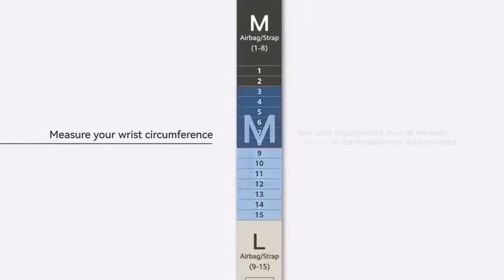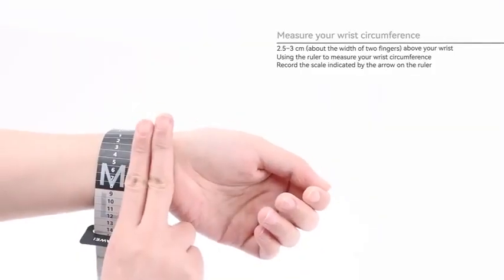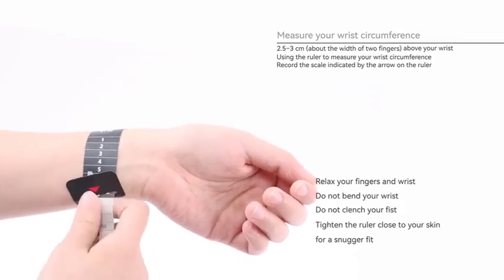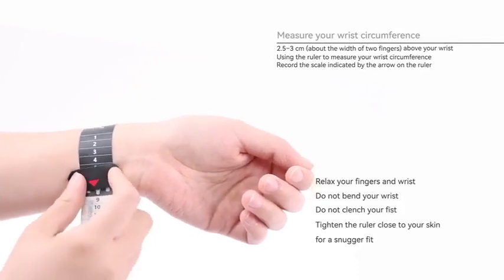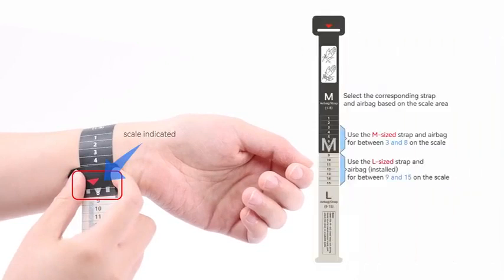Measure your wrist circumference. Notice the scale of the ruler provided. In order to measure your blood pressure, your wrist circumference must be between 3 and 15 on the measurement scale provided. Place the ruler 2.5 to 3 centimeters — about the width of two fingers — above your wrist and record the measurement of your wrist circumference. Then select an appropriate strap and airbag based on your wrist size.